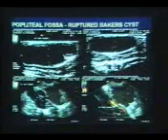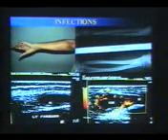A lot of aliasing is seen due to the compression and high flow going through this popliteal artery, and this is the blood which is seen in the ruptured Baker's cyst. Not only that, at times infection. Ultrasound is very good in evaluating the infection.